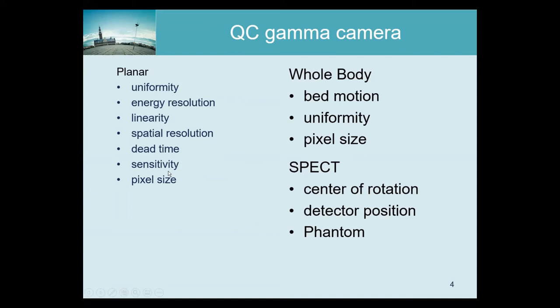What do you mean by the pixel size? You want to have that correct. If you draw a region and you determine volumes, you want those to be correct. So if you put two point sources at a known distance from each other, you make an image and you measure in the image the distance, that should be the correct distance.